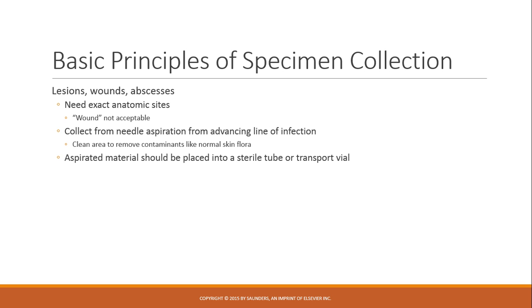And you want to clean the area to remove any normal flora, any contaminants that are present. So you want to clean the wound first and then collect the sample, and then place it in a sterile tube or vial.